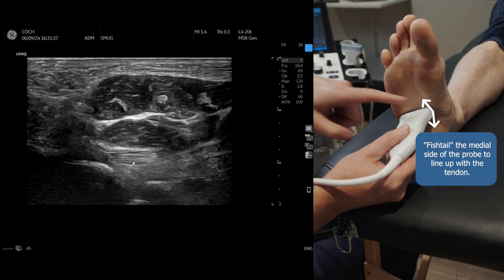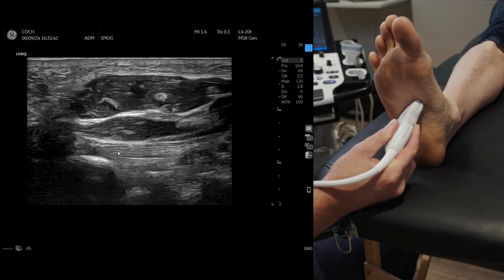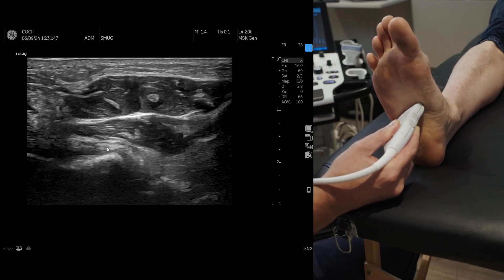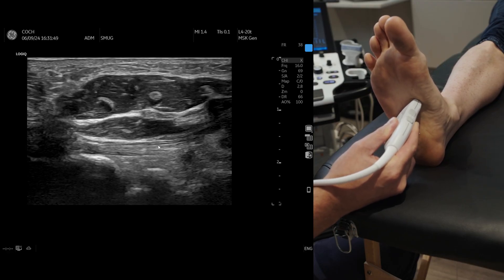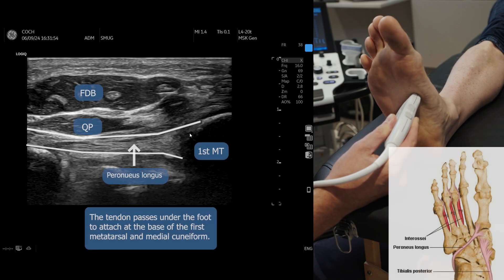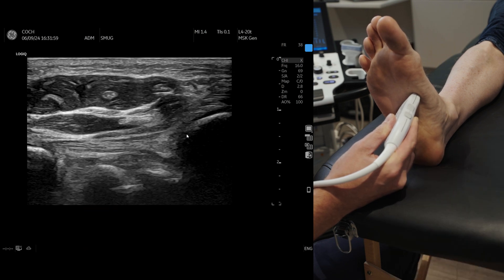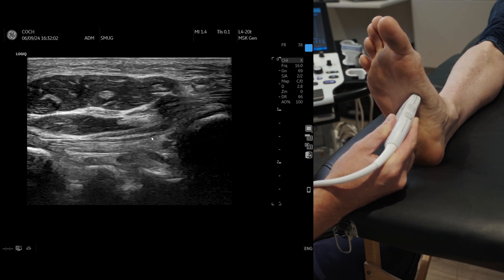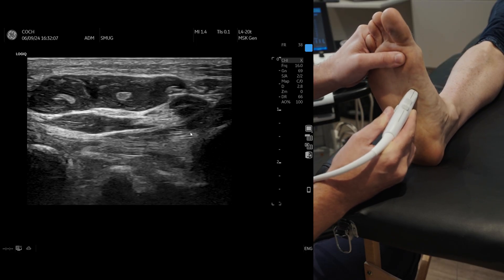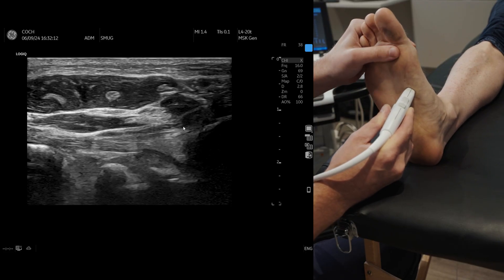Fishtail this side of the probe to line up the tendon, and we can see this lovely peroneus longus from the lateral side. Then fishtail until you see the peroneus longus come underneath, moving more medially, and you can see it attaching onto the first metatarsal. Remember, it also attaches onto the cuneiform. A little bit of dorsiflexion just to stretch the tendon, and we can now see that attachment really nicely onto the first metatarsal.